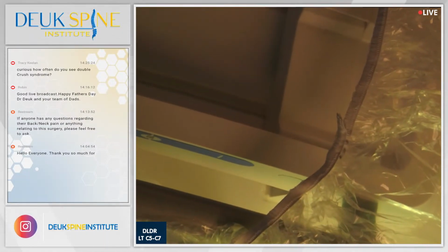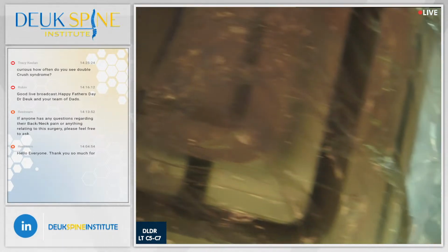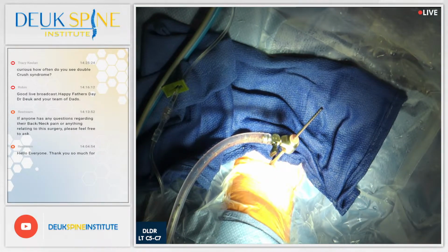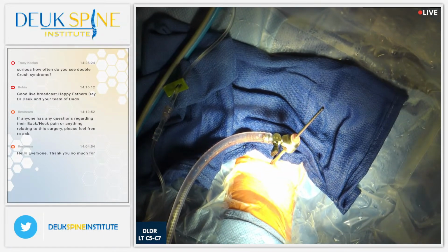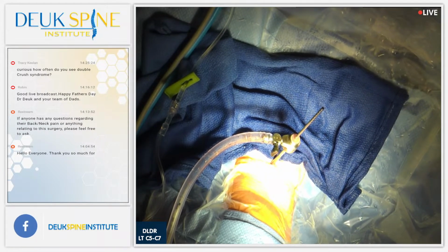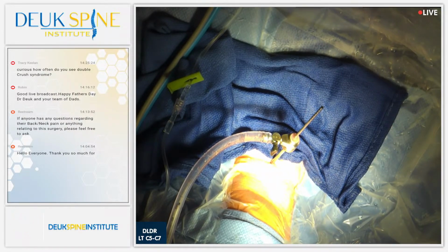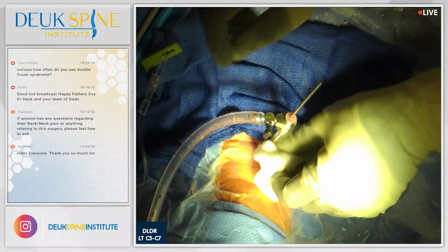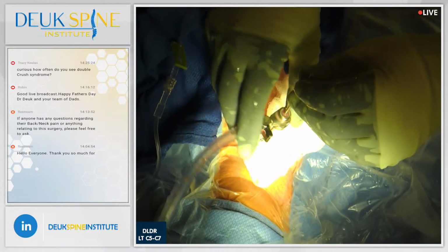All right. We're going to do the Deuk slide. The Deuk spine slide, where we slide down to the next disc. So we're going to need a little help. Let's keep everything sterile. You'll take the arms, you'll take the head. Jordan's got the fluoro, I've got the dilator, and Luis will get some of the shoulder if we need it. All right, 2, 3, 4, 5, 6. Everybody ready? Positions. Let's assume positions, and I'm going to get this tube out.